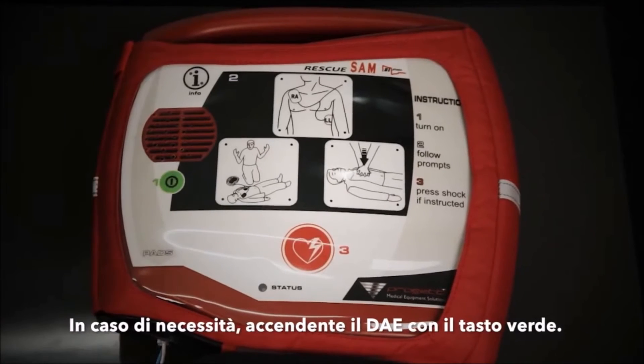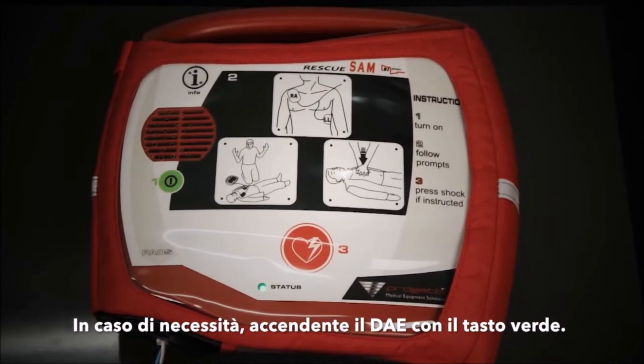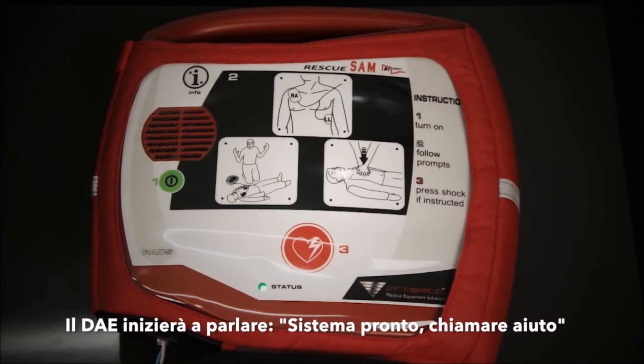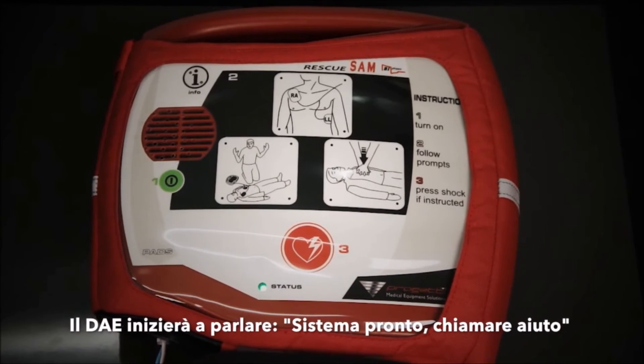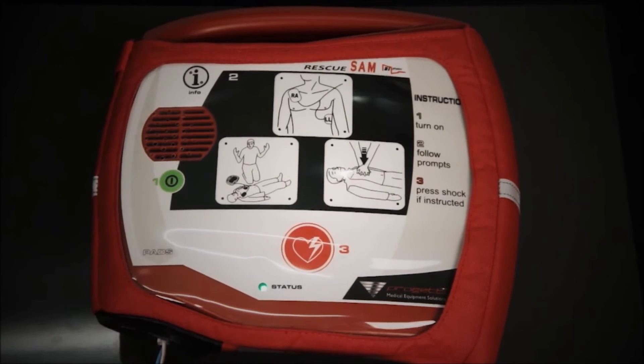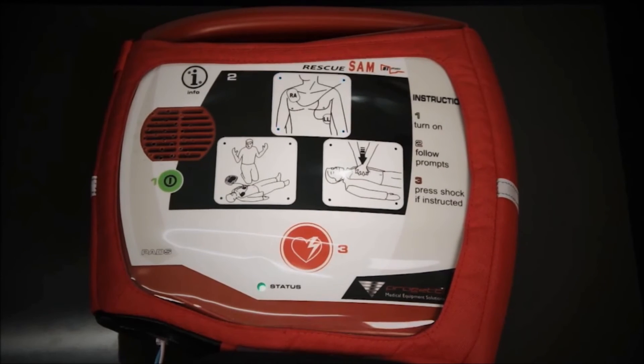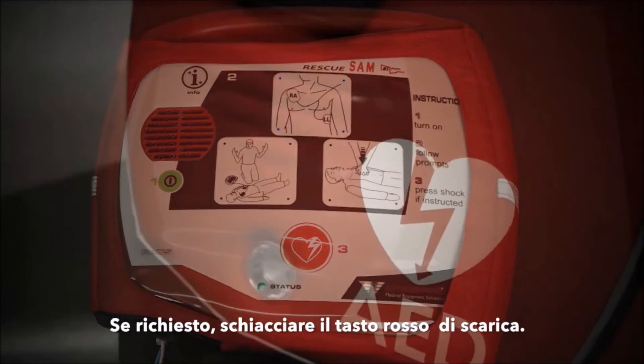Pressing the green power button will start up the defibrillator. Listen to the voice prompts and follow the instructions: 'System ready. Call for help. Attach pads.' When instructed, press the red shock button and listen out for further instructions.